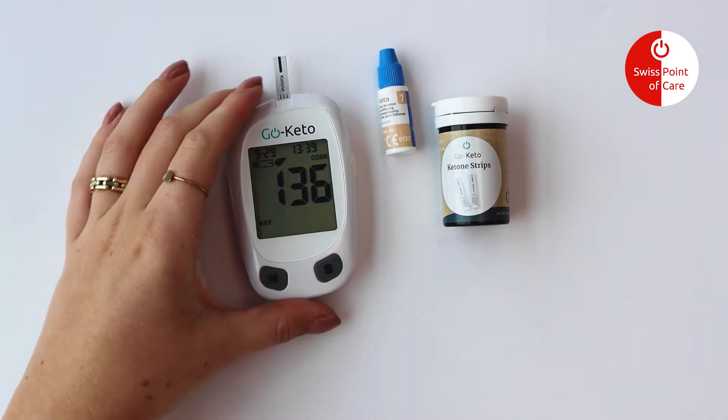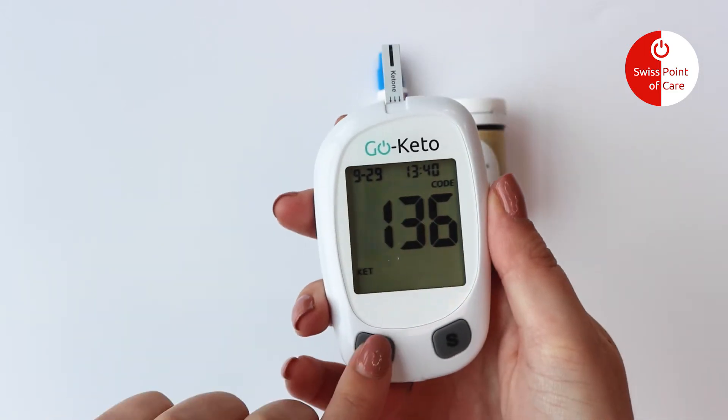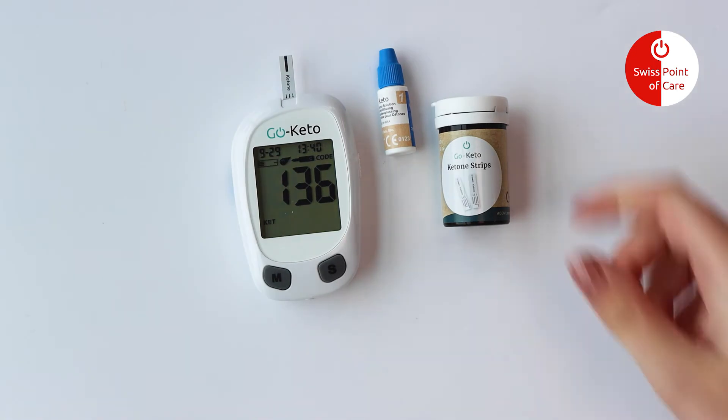When the blinking test strip and blood drop symbol appear, press the M button to mark the test as a control solution test. Then the control solution symbol will appear on the display.